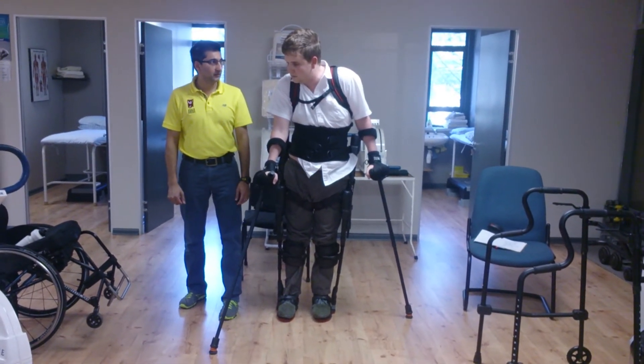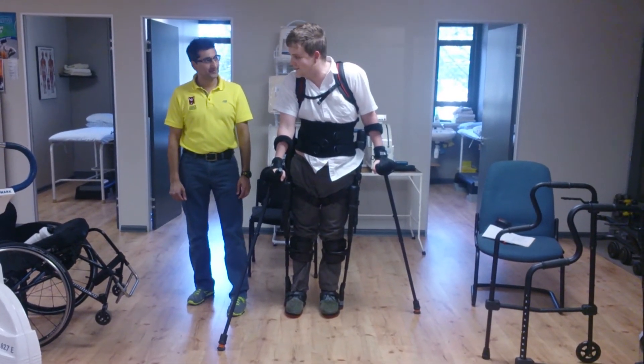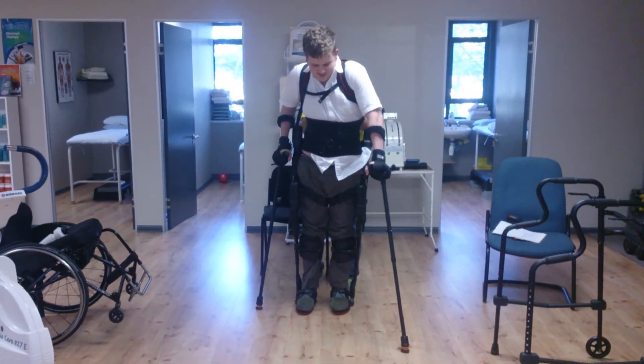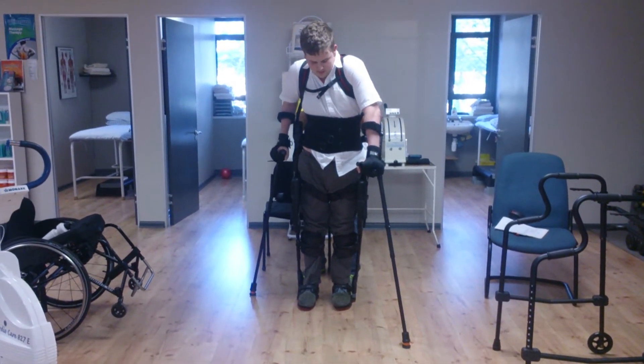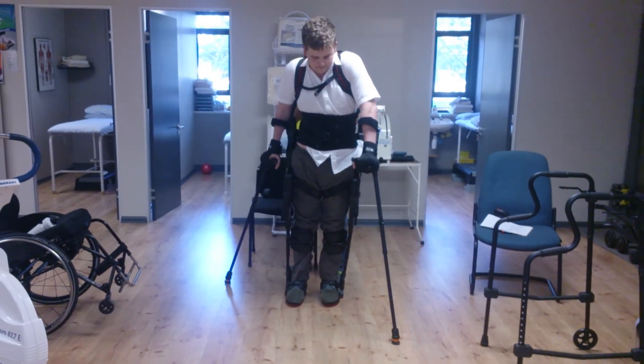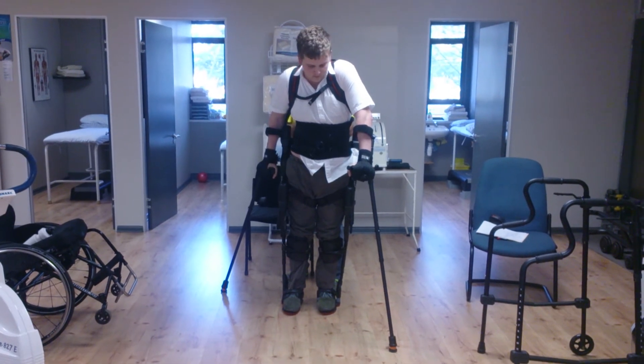Do that. Switch. Wide. That's it. If you bring it closer, you're going to fall. Take it wide. There. That's good. There you go.